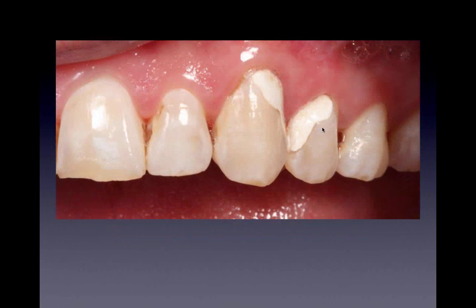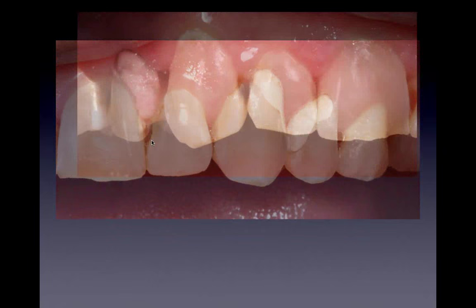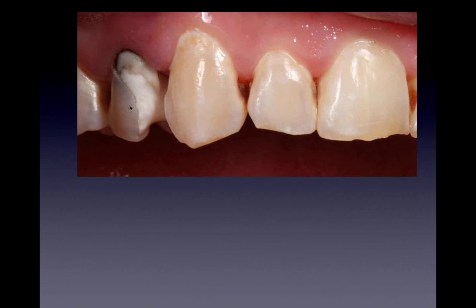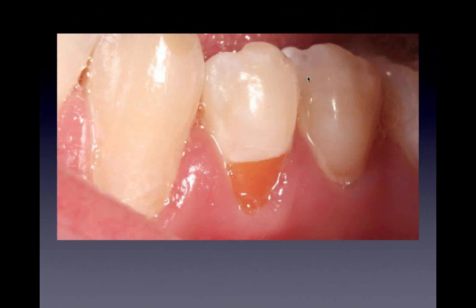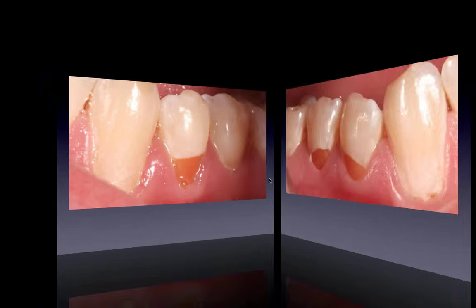Here's this tooth needed endodontic treatment. This tooth is going to be okay, but we kind of did them all in the same session. This tooth, again, needed endodontic treatment. I wasn't going to treat that. We're just talking about the anterior units right now, so we'll go ahead and take care of the posteriors first. For cervical lesions, we'll prepare it and get as much decay out as we can. It's usually further than you think, so I over-aggressively prepare these because there's more decay than you think.